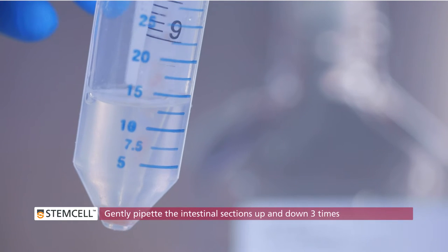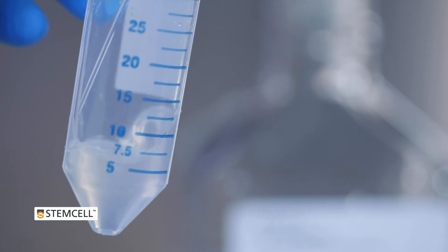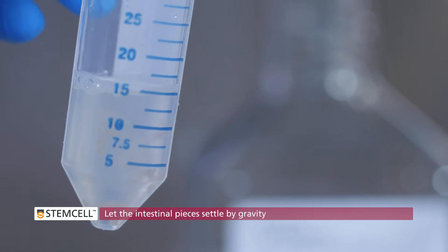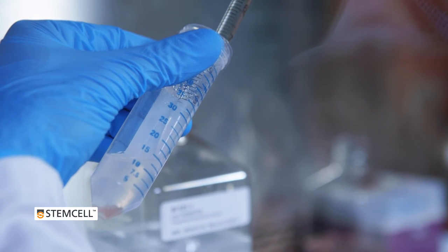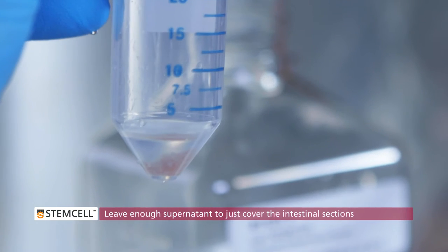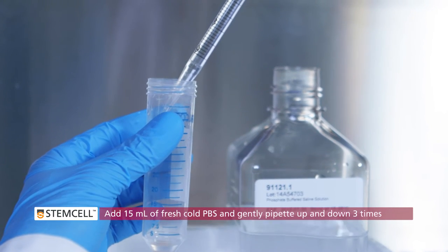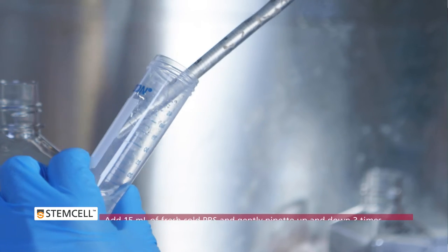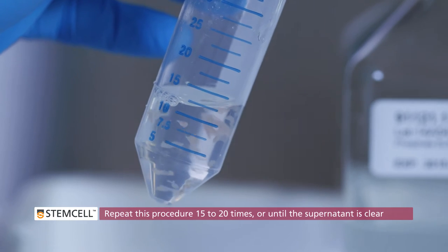Gently pipette the intestinal sections up and down 3 times using the pre-wetted serological pipette. Let the intestinal pieces settle by gravity, which takes approximately 30 seconds. Gently remove the supernatant, leaving enough to just cover the intestinal sections. Add 15 mL of fresh cold PBS and repeat rinsing by pipetting up and down 3 times with a pre-wetted 10 mL pipette. Repeat this procedure 15 to 20 times or until the supernatant is clear.